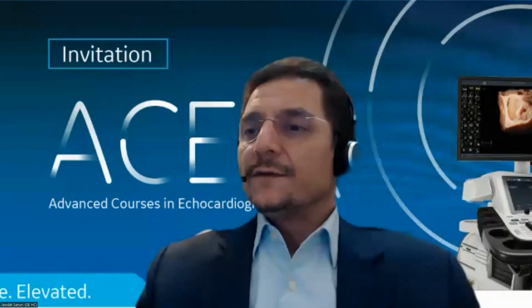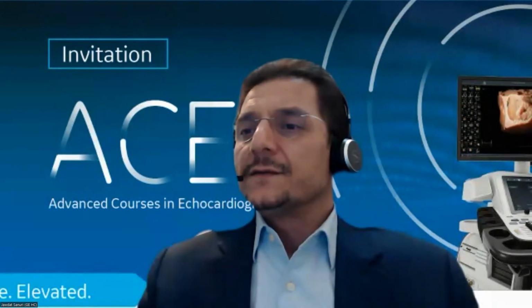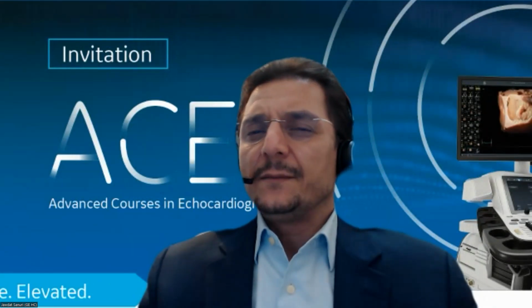What is the place of strain test for DCM follow-up and treatment response? What is the place of strain test for DCM? Can you please elaborate on that, Dr. Demike? And treatment response. I'm sorry, I don't get the abbreviation. What is DCM?